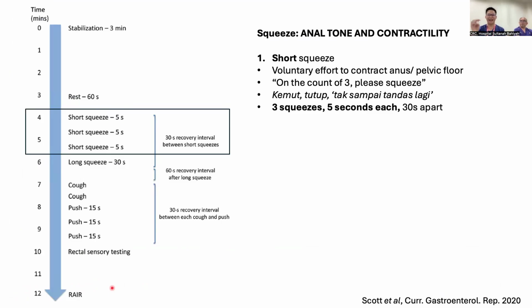After a rest, then you tell them to start doing some work. You start off by doing something simple. You tell them to squeeze. Now in Malay, in a colloquial word, the word that we tell them is kemut, and kemut means close.